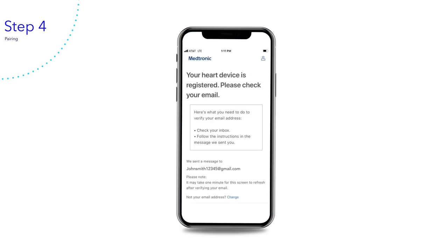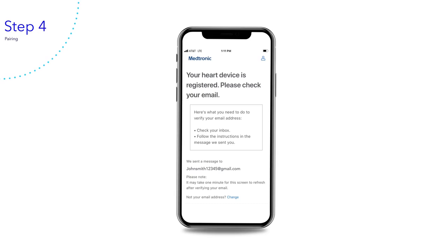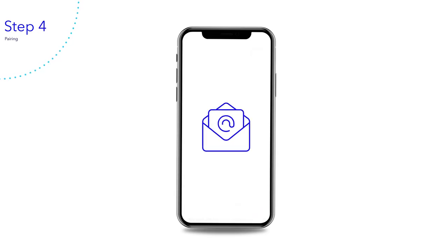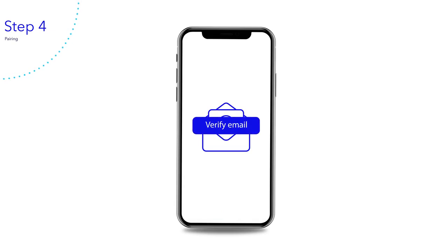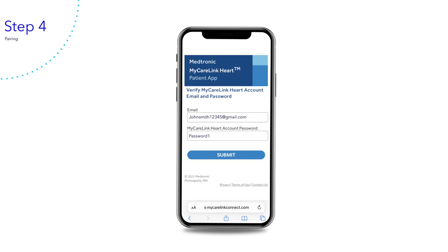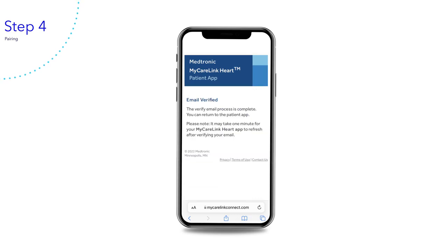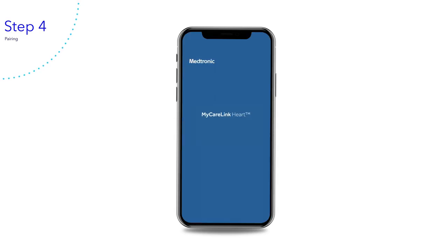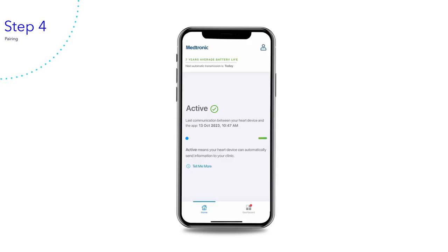Your heart device is now registered. To continue pairing your heart device with the MyCareLink heart mobile app, you will need to verify your email address. Exit the MyCareLink heart mobile app and navigate to your email to open the verification email from Medtronic. If you have trouble finding the email, please check your spam folder. Tap verify email to launch your browser, log into your account with the password you just created, and tap submit. Your email is now verified. Relaunch the MyCareLink heart mobile app — it may take one minute for the app to refresh after verifying your email.